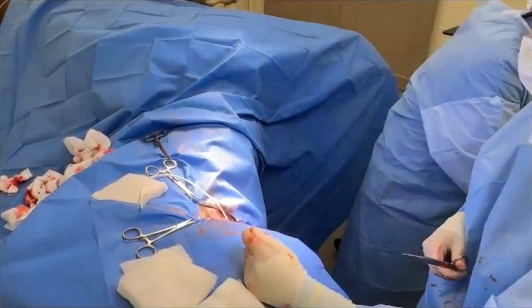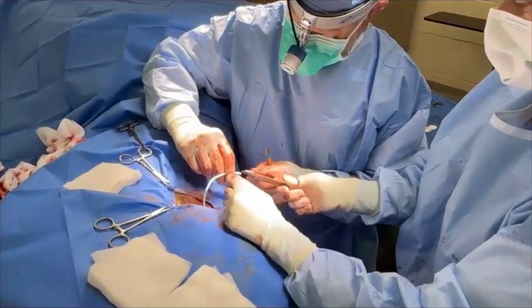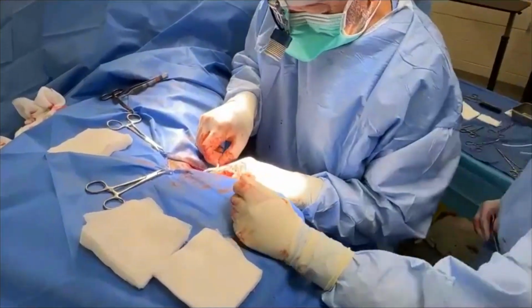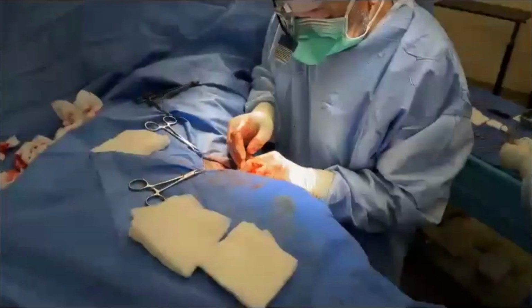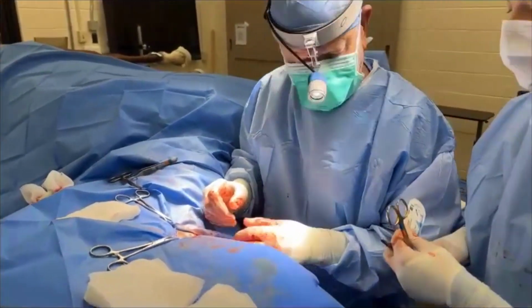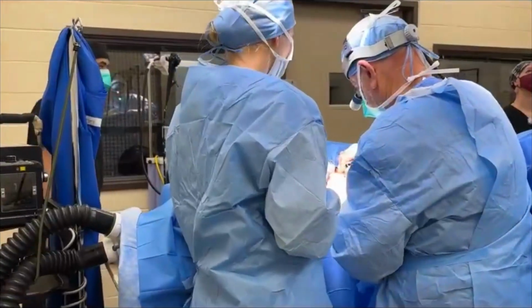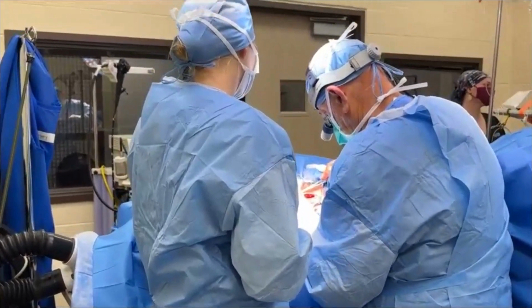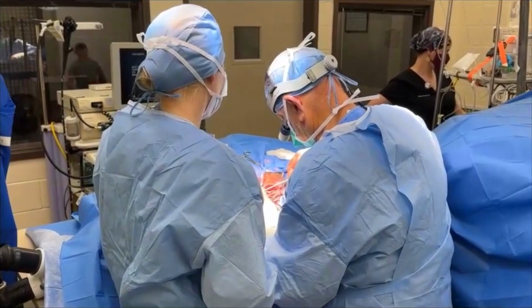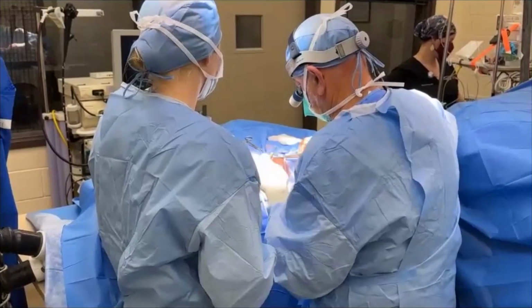So what's this thicker string that I'm seeing here? So that's a drain. When we separate the tissues in order to put the sutures in and around those cartilages, you separate a lot of nerves and vessels from the top of the larynx. And we don't suture that area back together because you'd be running sutures through arteries and veins and nerves, which is not what you want to do. And so almost all of these get a seroma or fluid pocket above the larynx where we had just worked.